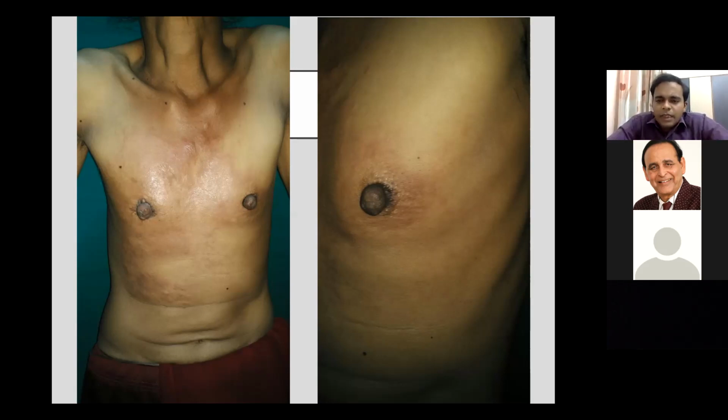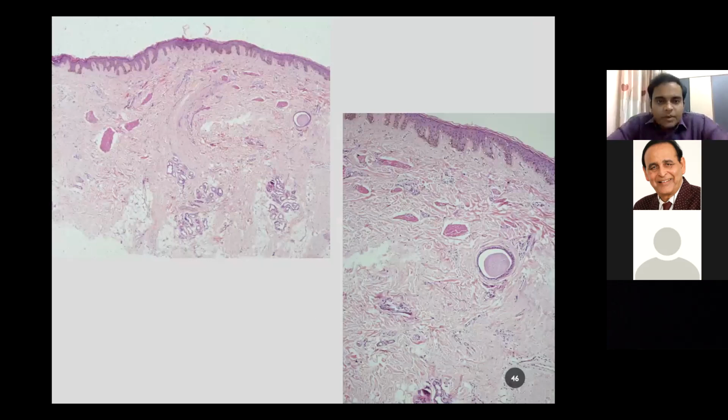And when we looked at histopathology, it is absolutely non-specific. Okay. So what we were expecting clinically is not there histologically. So these are some of the subtle or invisible dermatoses histologically. Okay. What you are able to see is just fibrosis and nothing pretty. That's all, nothing else. So when we looked at this slide, we were unhappy. So we asked our histopathologist to do more and more sections and deeper cuts. So eventually, when we did deeper cuts, some findings started to show.